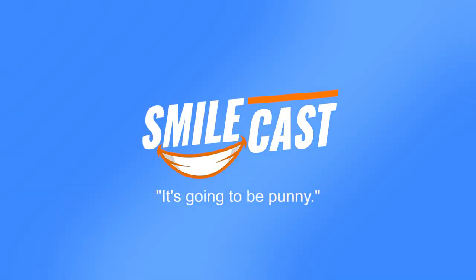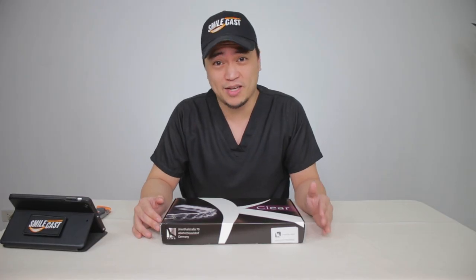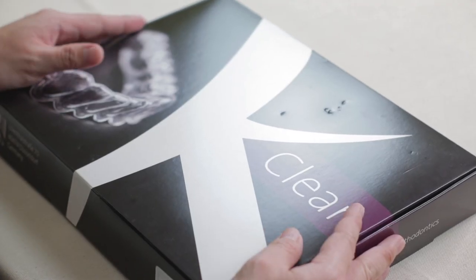Hey! When I say braces, what do you usually think of? Wires, metal, paint, right? Nowadays, we have the option of aligners. Aligners are custom-made trays that fit over your teeth. Today, we have one such system from K-Line and it's called their K-Clear.